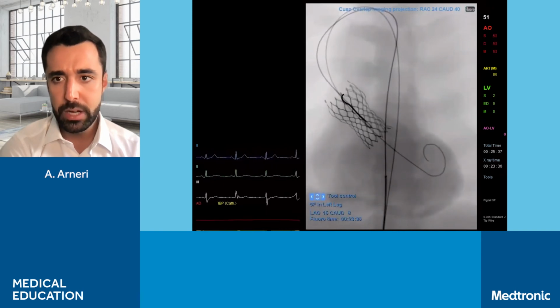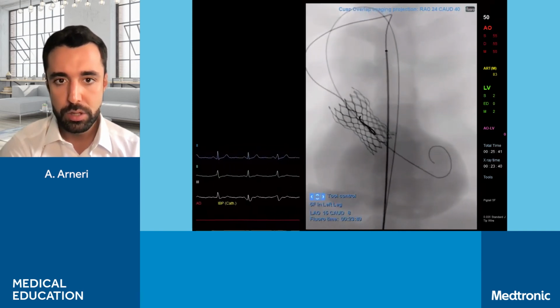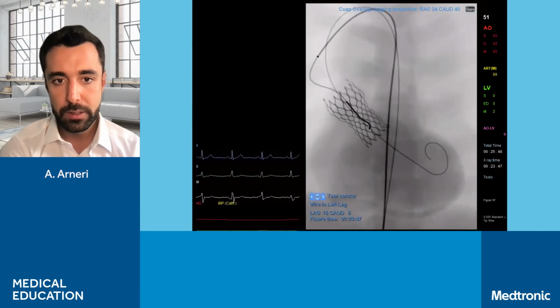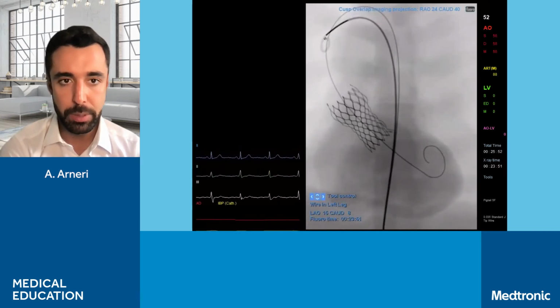We can keep it there, George, to do the contrast injection. Sure, let me remove the wire. Okay. Now we pull back the wire as well. Okay, perfect. We can keep the pigtail there.